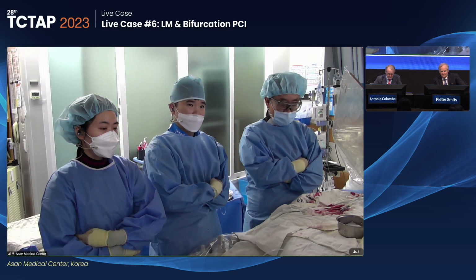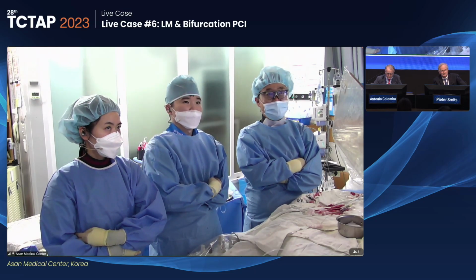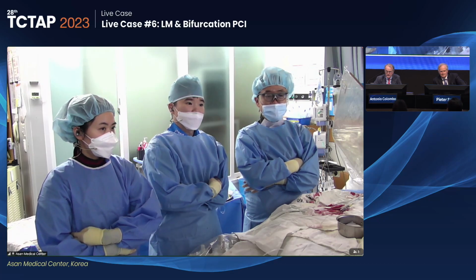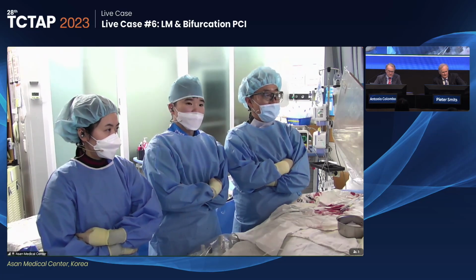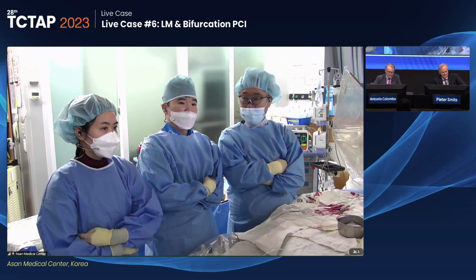Okay, so I'm going to start my session. I'm D.W. Park from Asan Medical Center. The first assistant is our Asan Medical Center alumni, Professor Yong-Hoon, from Chungnam Sejong Hospital. The fellow is Young-Sun Park.